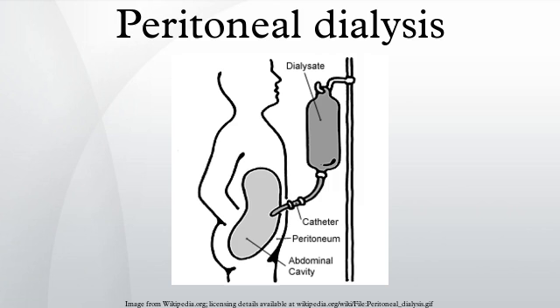Peritoneal dialysis is a treatment for patients with severe chronic kidney disease. The process uses the patient's peritoneum in the abdomen as a membrane across which fluids and dissolved substances are exchanged from the blood. Fluid is introduced through a permanent tube in the abdomen and flushed out either every night while the patient sleeps or via regular exchanges throughout the day.